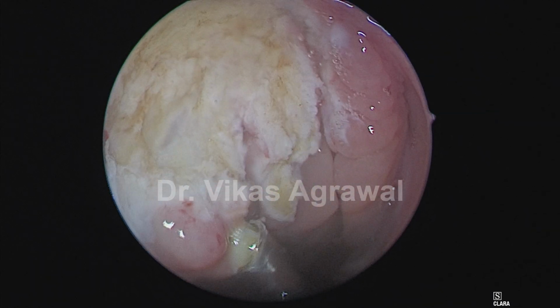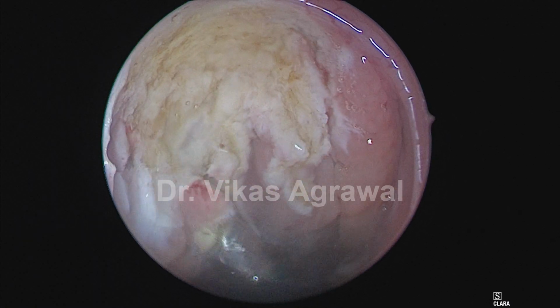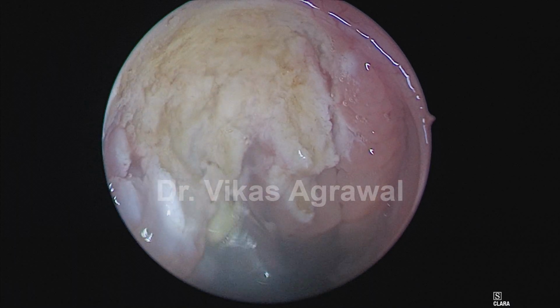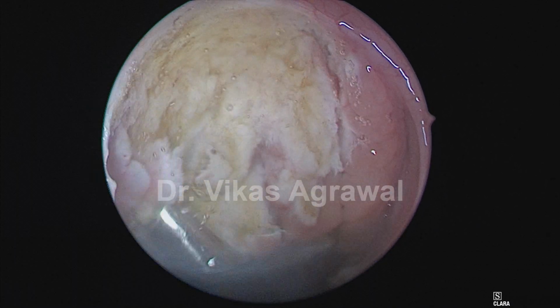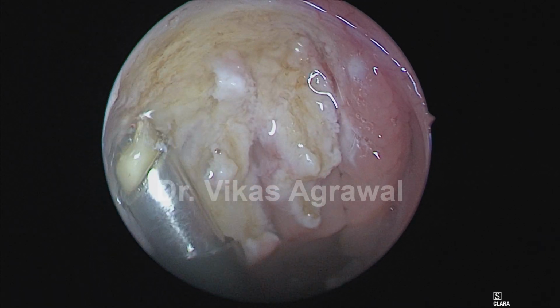And now you are able to see the whole extent. You are able to see the torus tuberous and the eustachian tube on the lateral side. I am debulking the adenoids on the medial aspect right now.